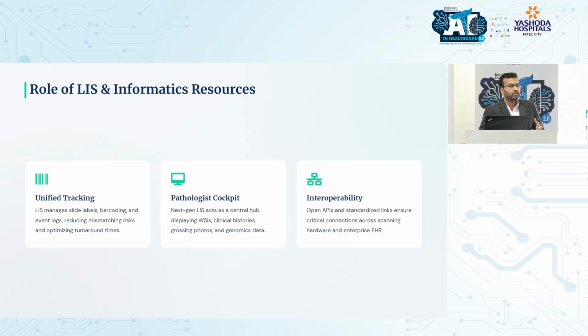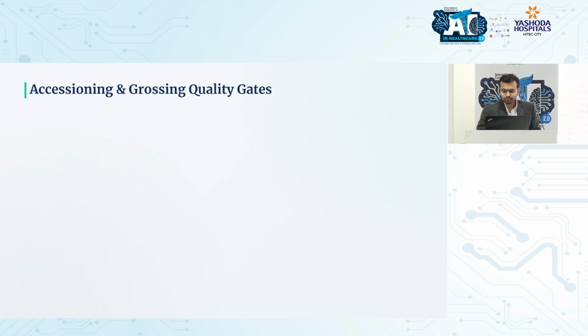Software has to be willing to integrate with other software. That is the most important factor. You cannot have a closed box. If you have a closed box, you're dependent on that one vendor for everything, which again leads to problems. It will lead to technological slowdown of your lab, and then every single integration will mean that you have to change something or the other, and cost gets added to it.